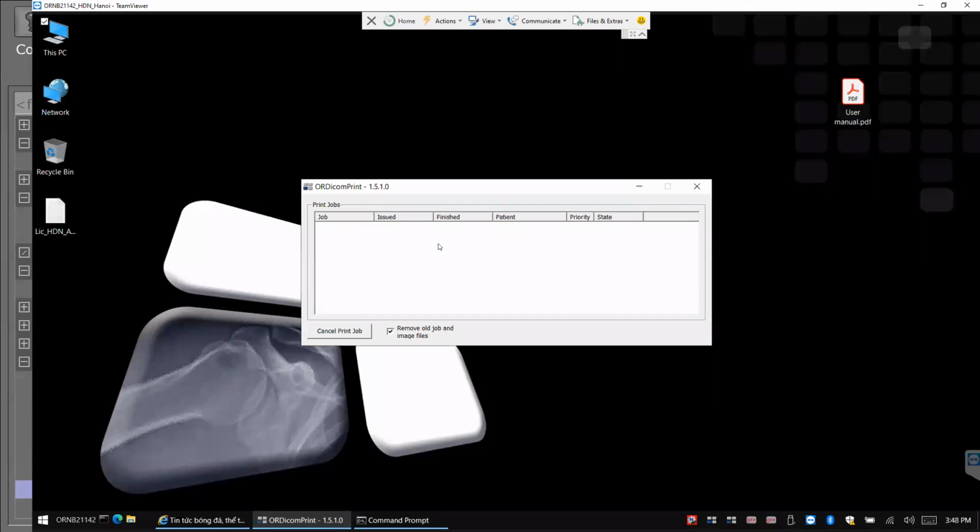Anything else? Okay. Another question. How can we check the working of all components via the software? How do we check the working of all components via the software or laptop, notebook?